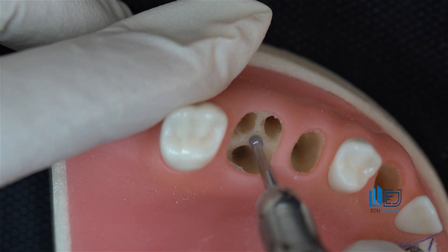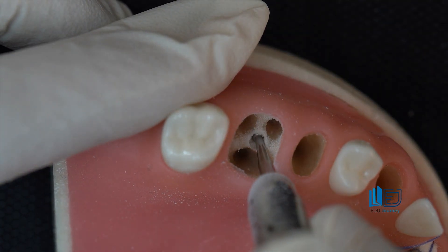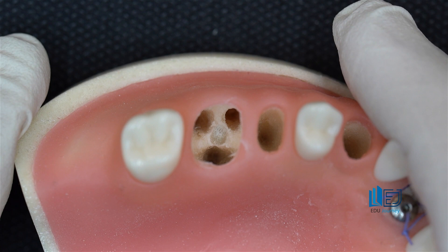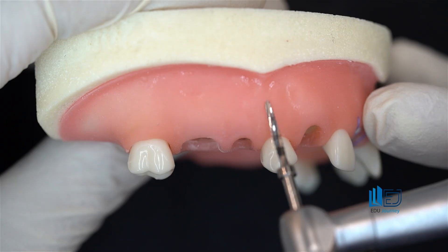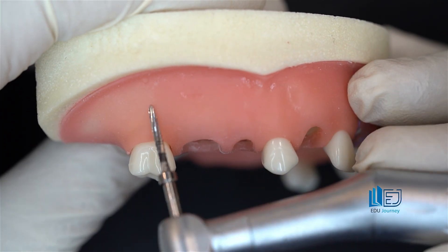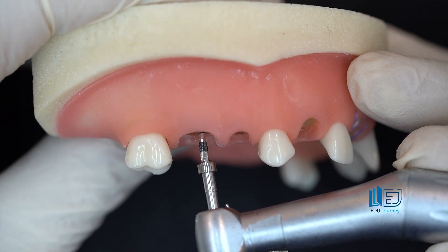You saw that I turned the prominent sharp furcations into a flat surface — it's even a little bit concave — so that my starter drill wouldn't slip. I did this using a round drill and a straight handpiece. Now using the starter drill, pay attention to the natural mesial angulation of the teeth. We're keeping the curve of Spee in mind, and we're also considering the Monson sphere. If the direction of the crown and root of the posterior tooth looks good mesiodistally on the OPG, that serves as a guide. All of these help you perform your drilling in the correct mesiodistal direction.